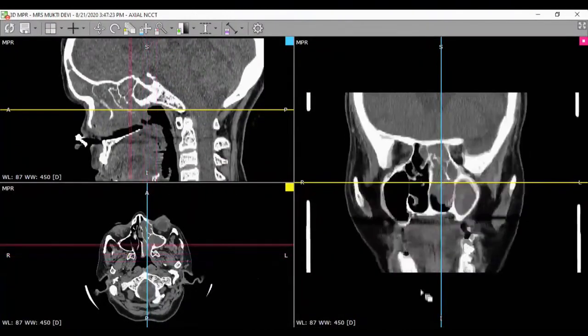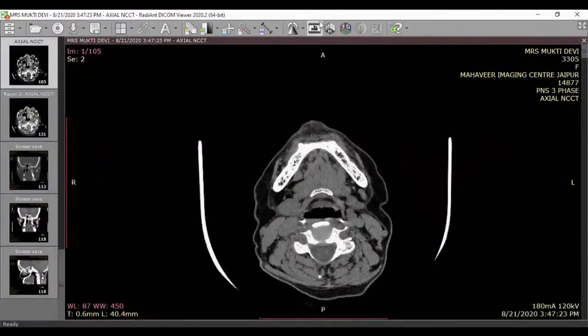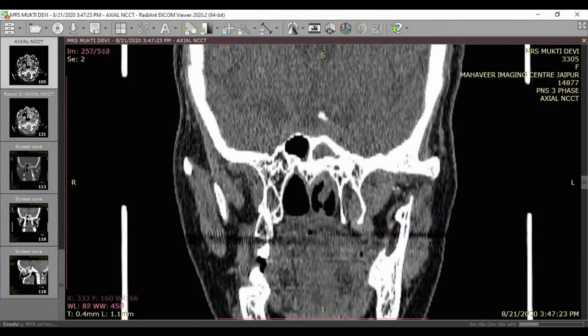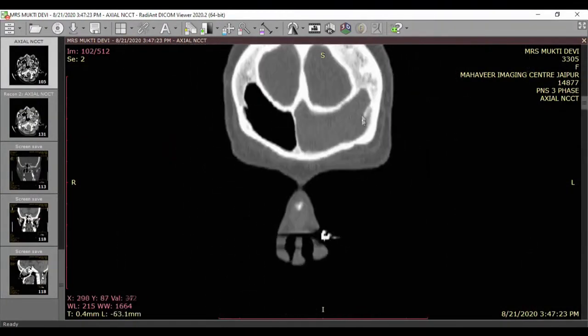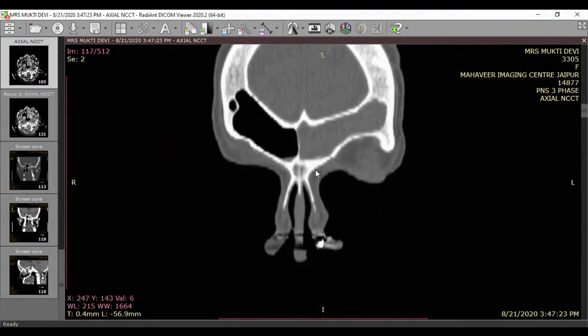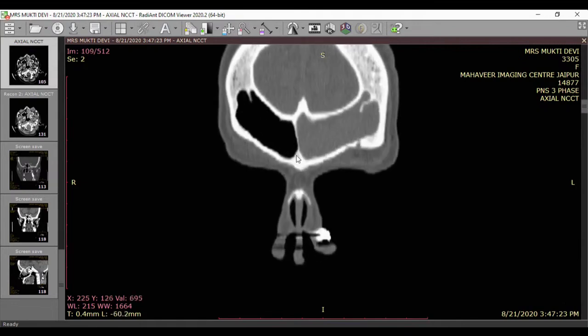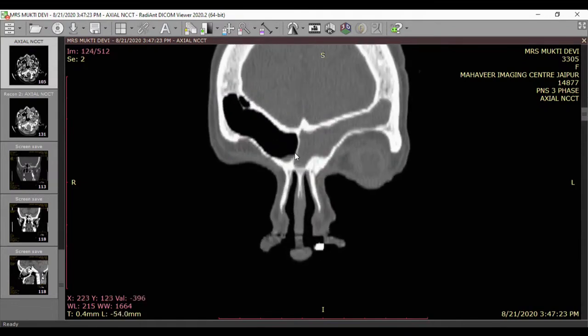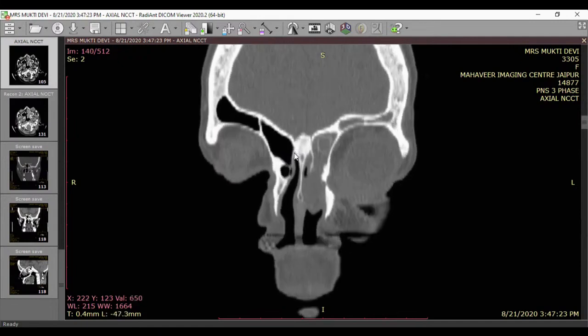See this particular patient. Let me show you the coronal and you can pick up what kind of cell it is. That's an important finding. See, I will run the CT scan and show you. See the frontal sinuses? Absolutely no cell so far. This is the clue. See, right from anterior here, no cell so far. Now see carefully. Can you see some cell appearing in the left side?